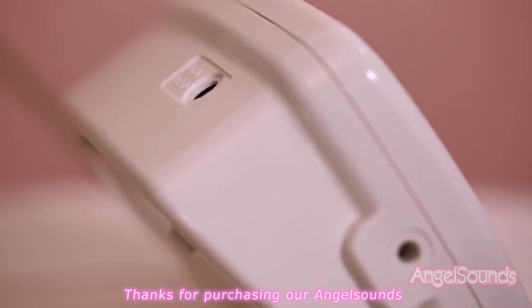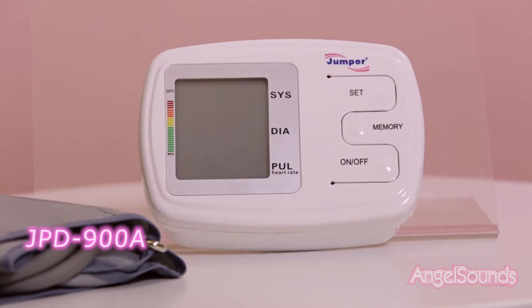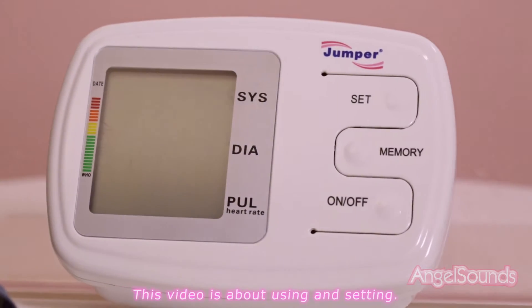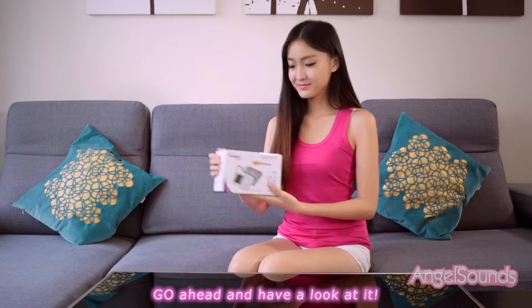Thanks for purchasing our AngelSounds JPD900A. This video is about using and setting. Go ahead and have a look at it.